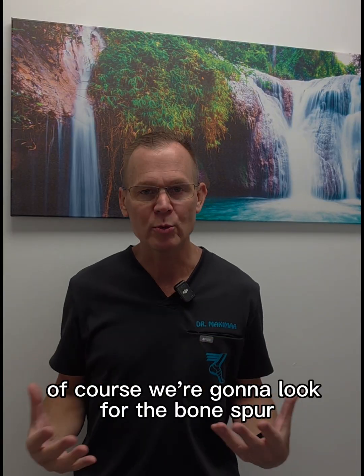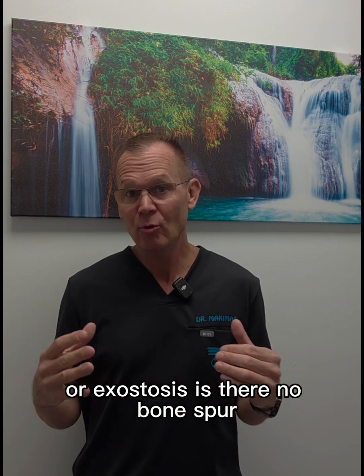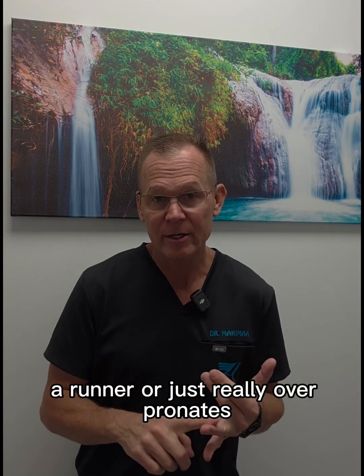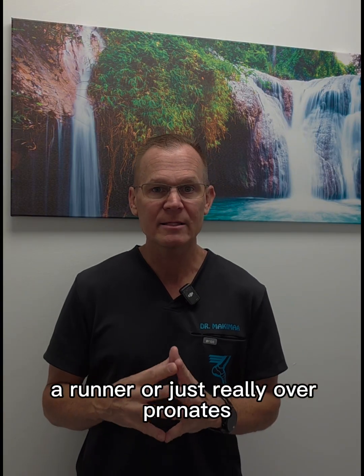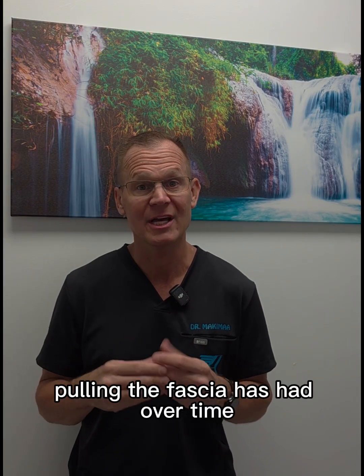So a final summary of X-rays. Of course, we're going to look for the bone spur and explain the bone spur to the patient, or exostosis. Is there no bone spur? Does it say, this hasn't been happening for very long, or maybe we need to look at different diagnoses? Or is it a huge spur that says the patient may have been overweight, a runner, or just really overpronates and having that fascia pull for a very long time on the spur on the bottom? Again, the spur is not what's painful, but it does give an idea of how much traction, pressure, pulling the fascia has had over time.